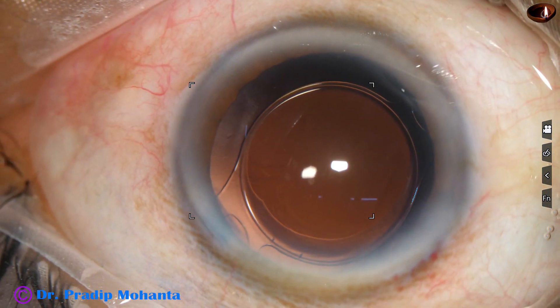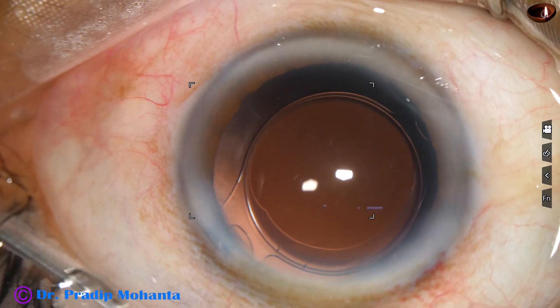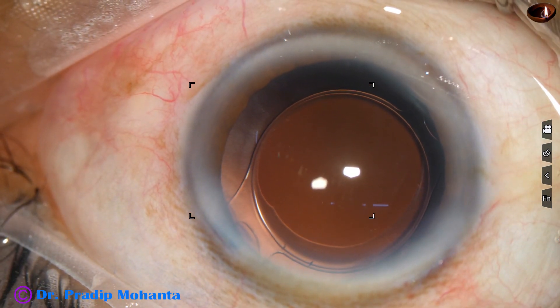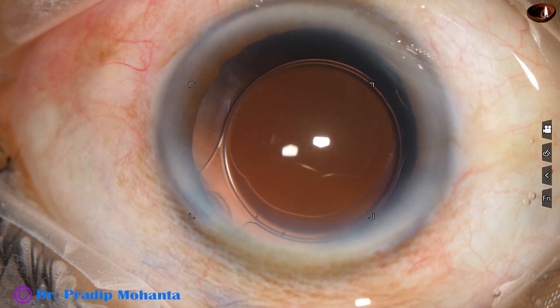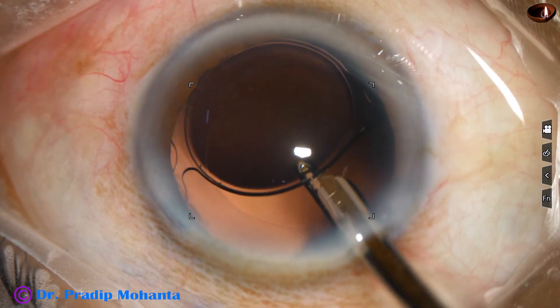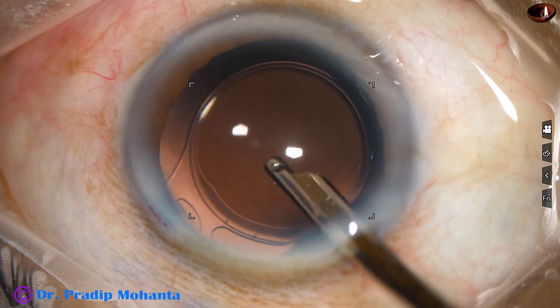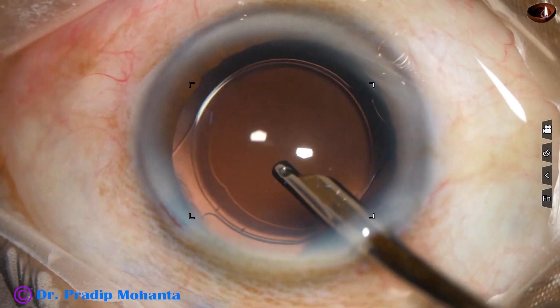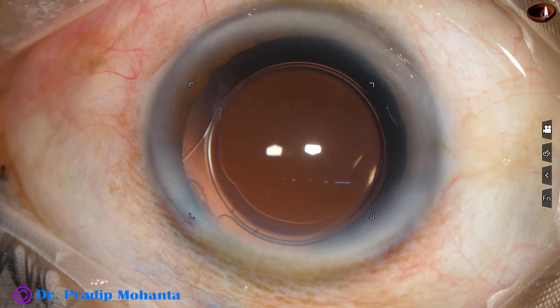This is a bit of moxifloxacin. Only one side port was present in this case, and it is closed by hydrating the corneal stroma. A final lavage of the anterior chamber is done. The anterior chamber is formed very nicely, the capsular bag is washed nicely, the anterior chamber is formed very firmly, and the case is concluded.